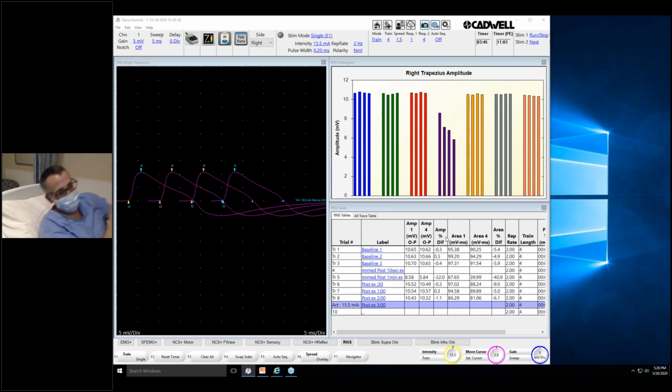Well, so that's a several part question. First of all, you can use any nerve that you can stimulate and that you can stabilize. Theoretically, you could use any motor nerve. So absolutely you can use the femoral nerve, if in pediatric patients you can stabilize and they're not tensing up the muscle. So that would be my question: if they're crying, are they shaking their legs and moving around, which would lead to some technical problems? But you could use it.